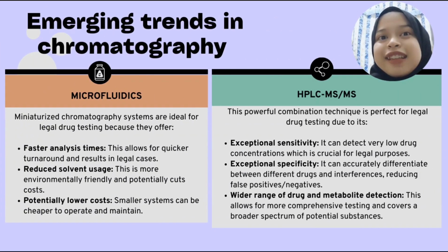Next, emerging trends in legal drug testing. First, one of the key emerging trends is microfluidics. Miniaturized chromatography systems are ideal for legal drug testing because they offer, first, faster analysis time. This allows for quicker turnaround of results in legal cases.